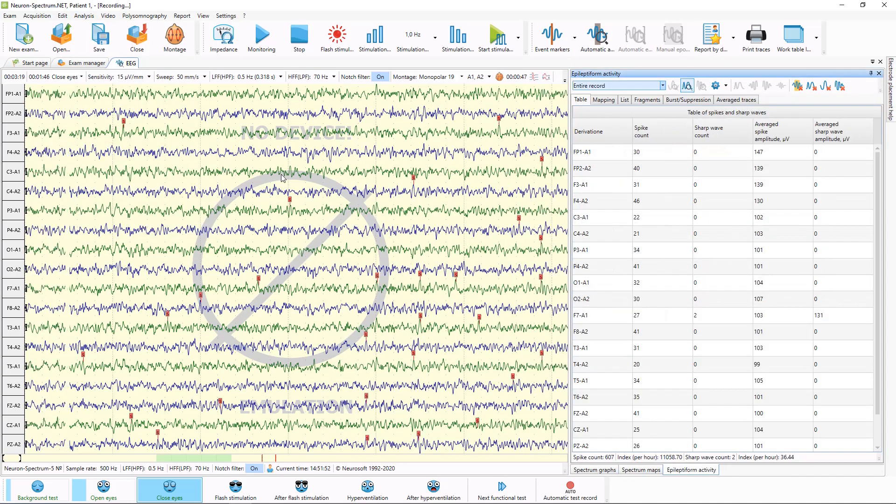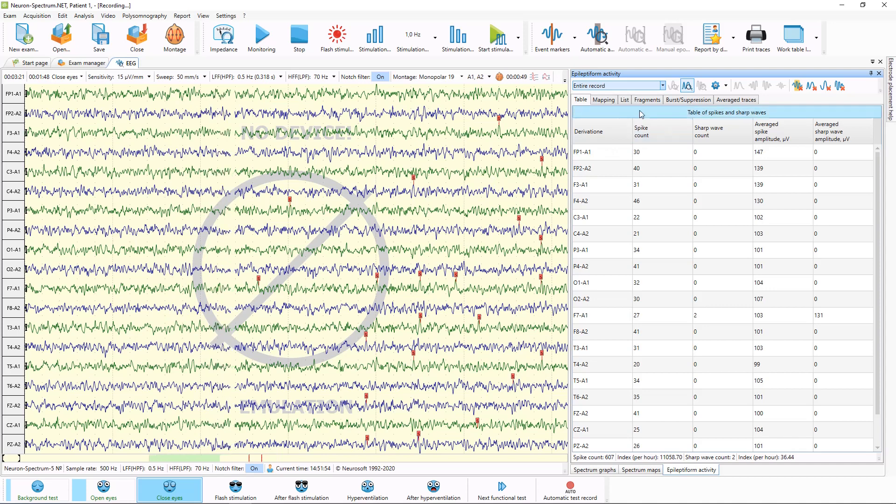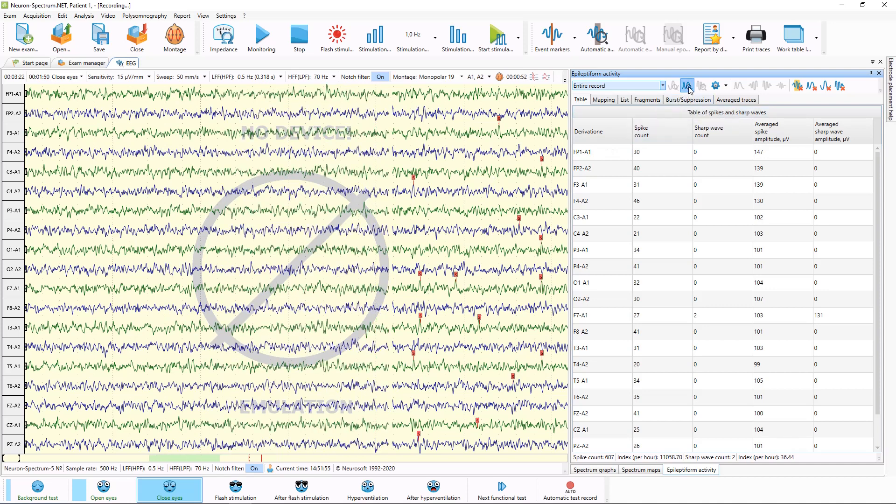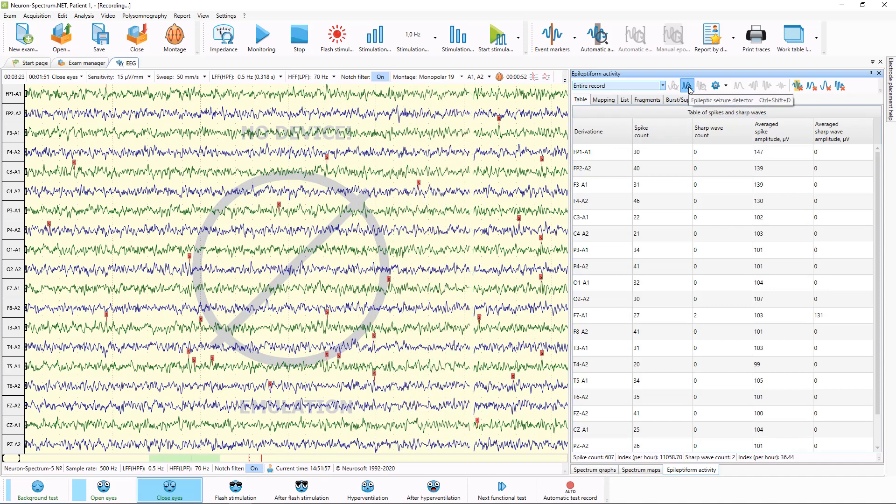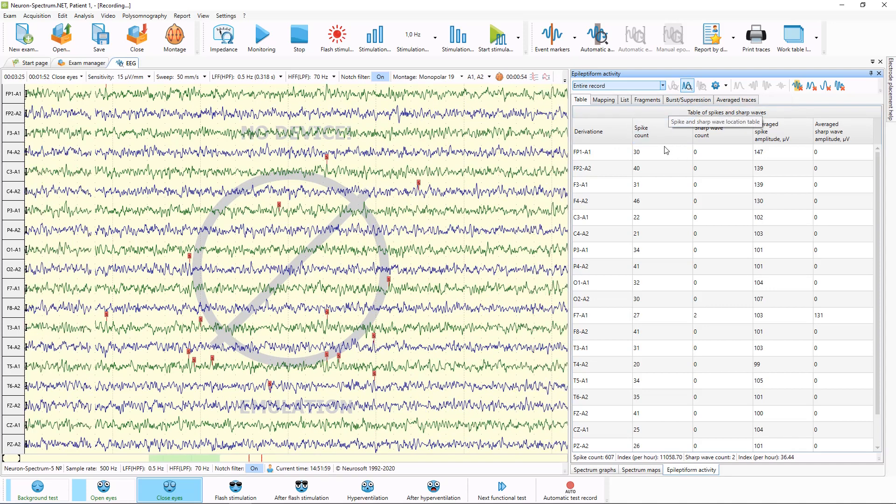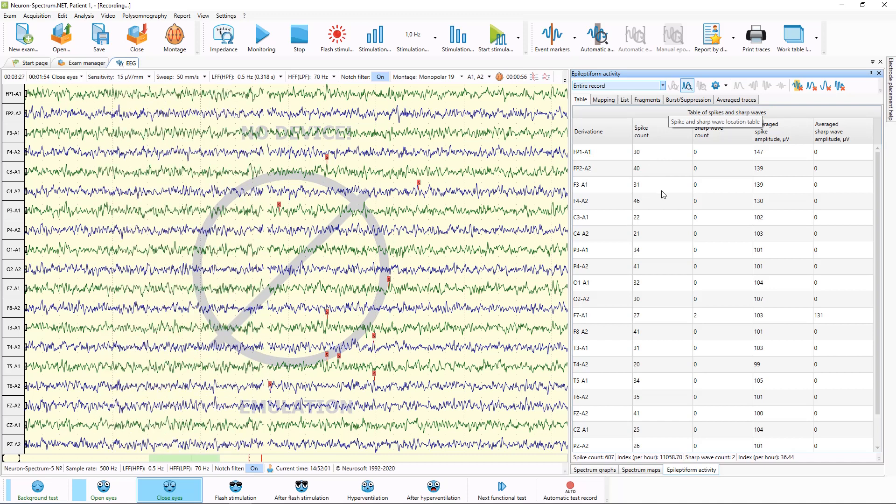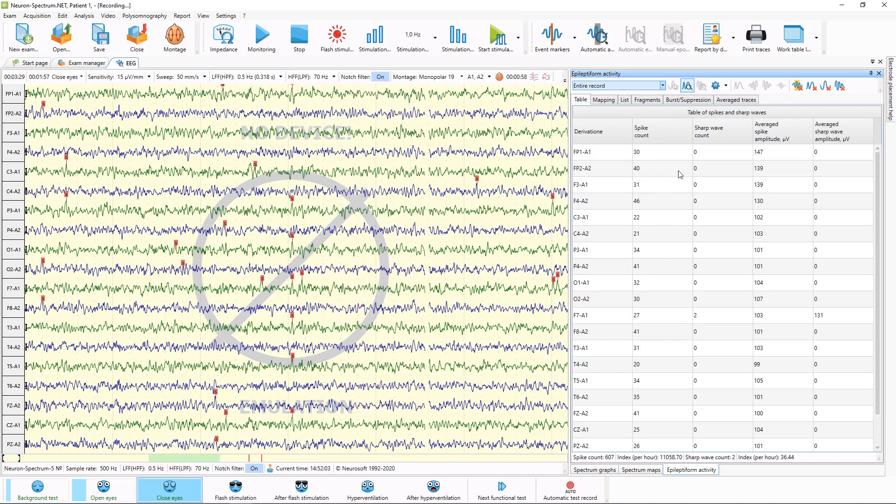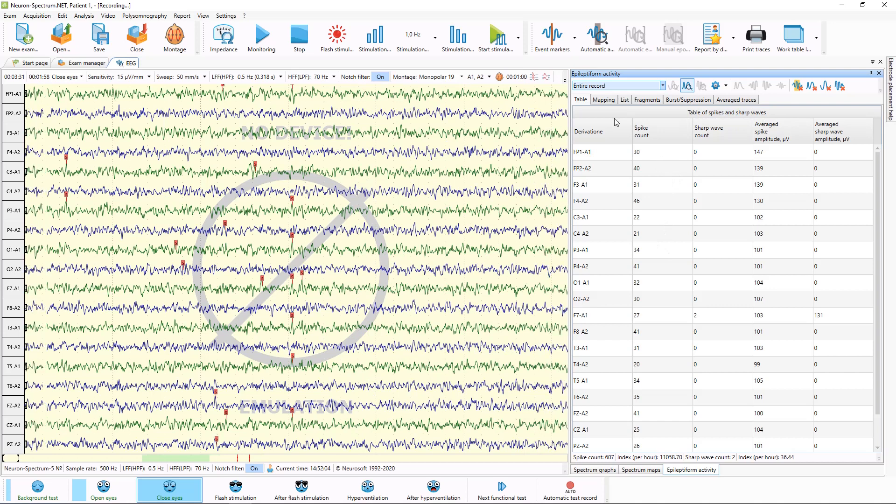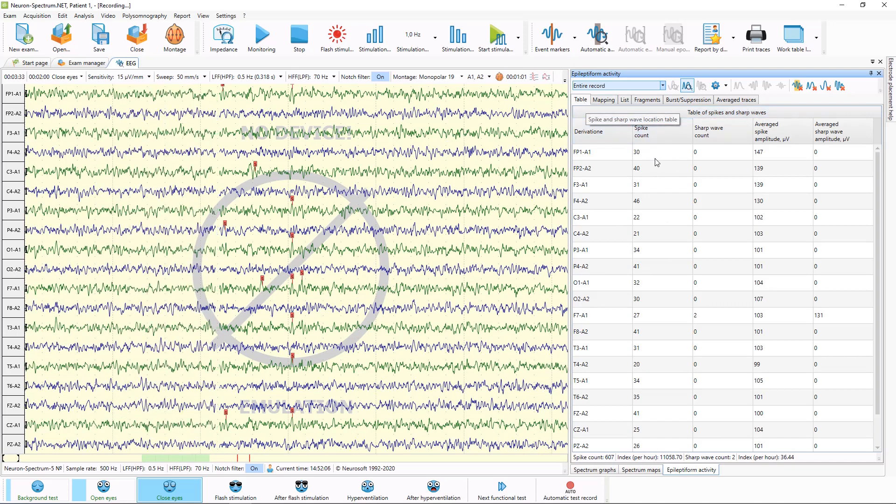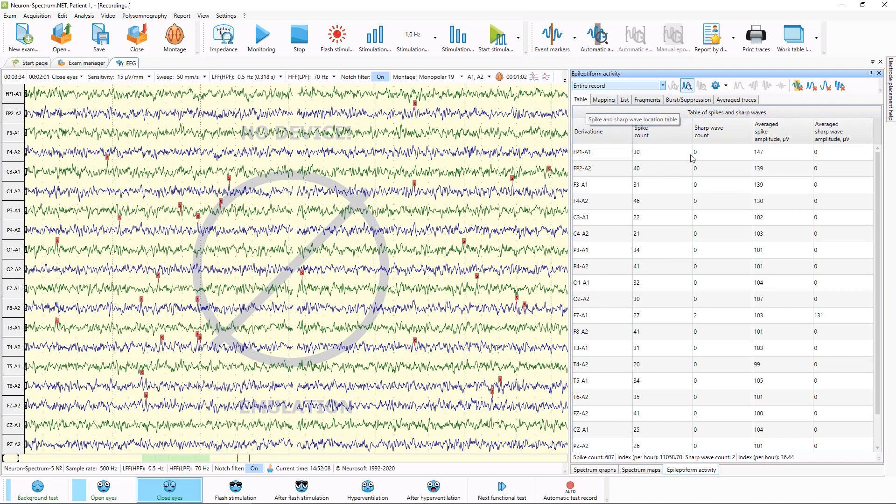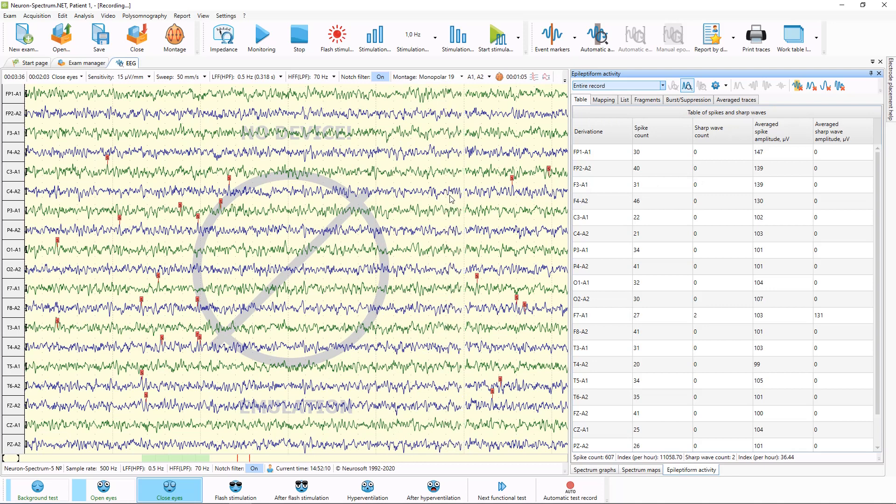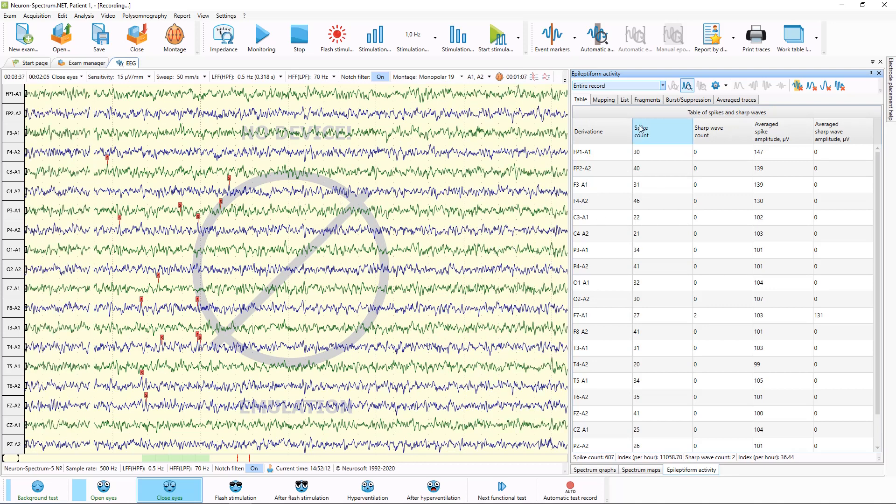In epileptiform activity window, you can start or stop epileptiform activity detector, and also you can review results of epileptiform activity analysis. Here on first tab, you can see table with all spikes and sharp waves which are found on the traces.